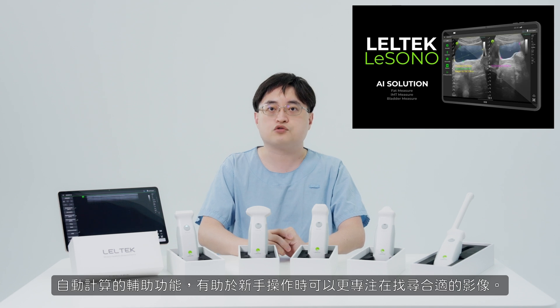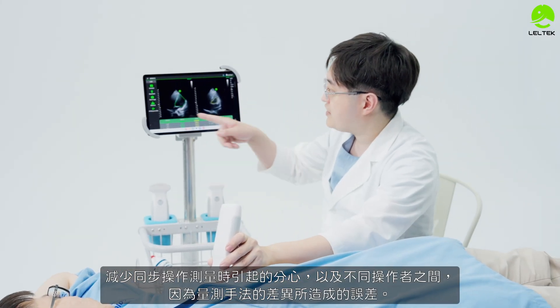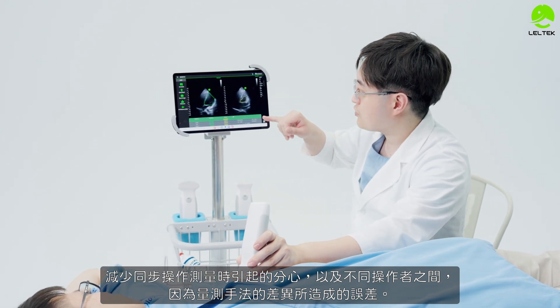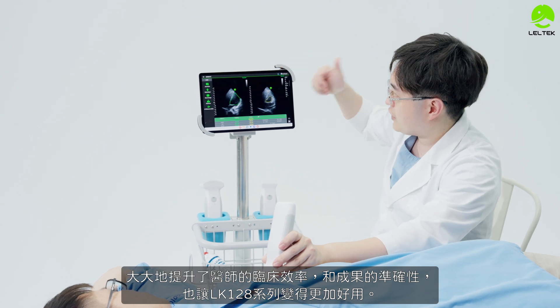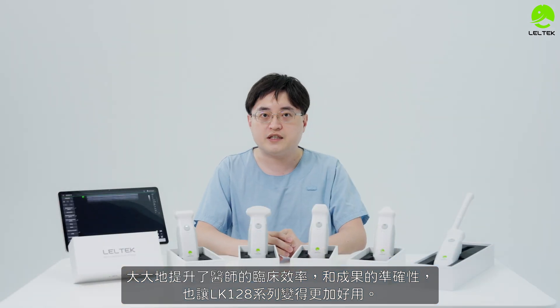This allows users to spend less time on manual calculations and more time focused on results, which ultimately increases patient outcome accuracy. The LK-128 series will be better to use overall.